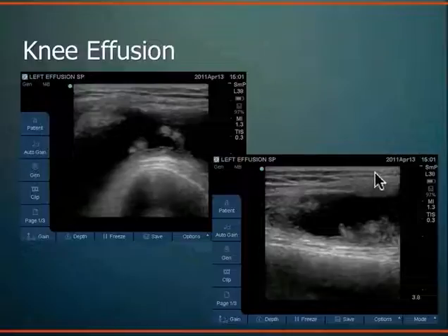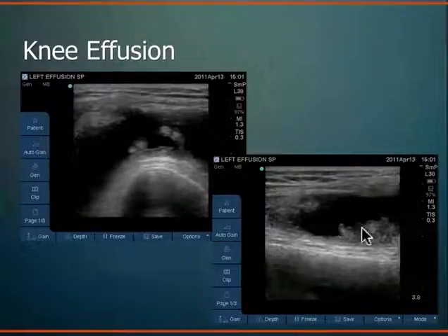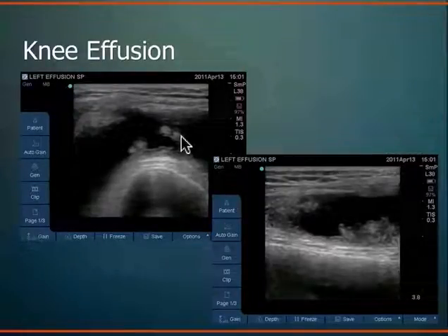This is that suprapatellar pouch of the joint space. So the knee joint space extends pretty far above the knee on that suprapatellar pouch. And when you have a joint effusion, that area can be extended or distended. And this is the fluid collection in there. So all fluid with some joint debris floating around. This is just a chronic kind of classic osteoarthritis presentation, seen quite well.